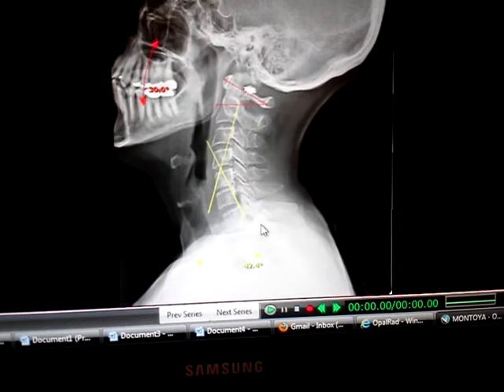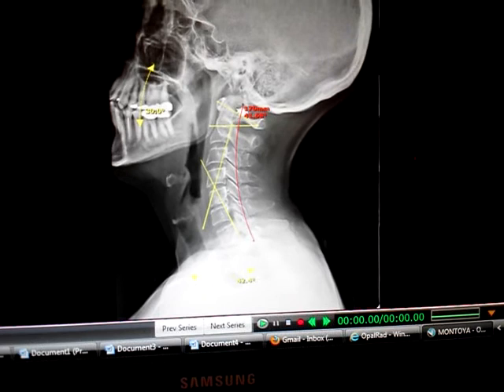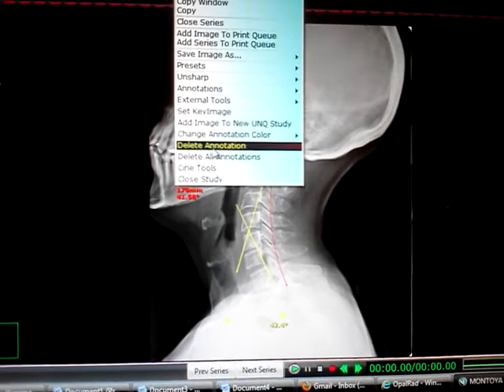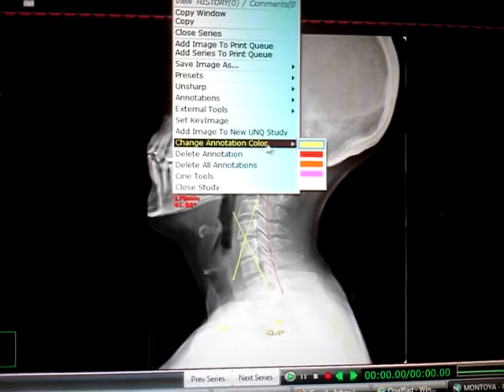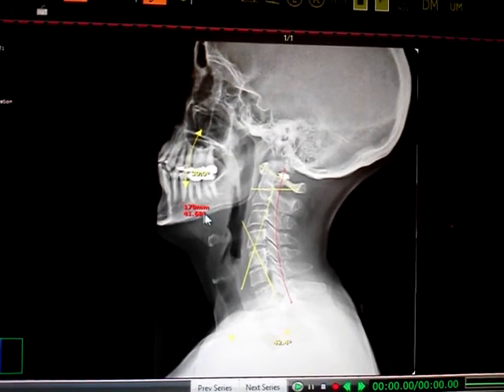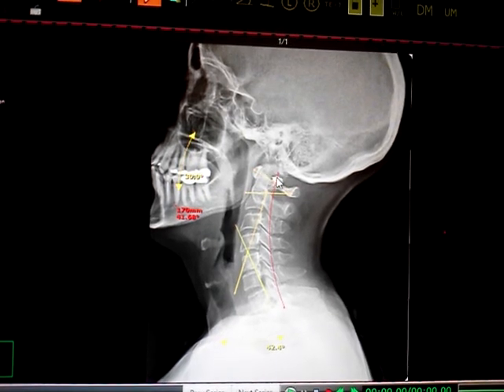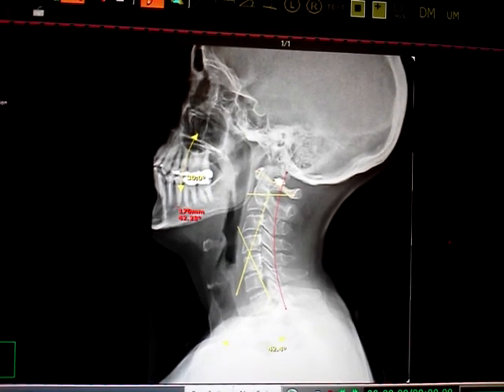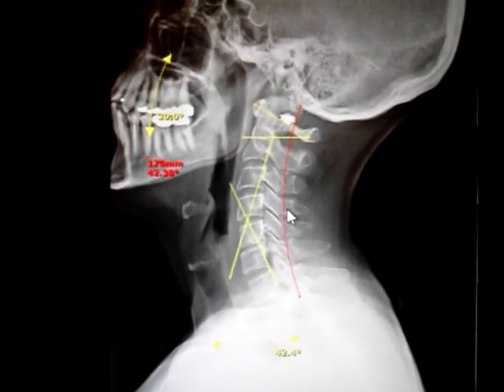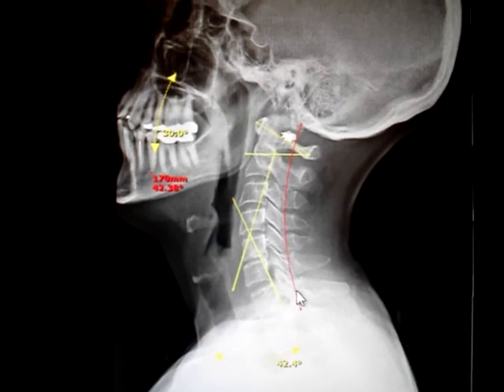Click on the back of C7, just in the back here somewhere, and then go straight up to the top of the C-spine. The point of this line is just to show what an ideal curve should look like. Make it red by right-clicking to deactivate, left-click to reactivate the line, then right-click again for the menu to come up, and go down to change the annotation color. You can see this is a pretty good-looking cervical spine, and the curve is pretty parallel with what an ideal curve should look like.